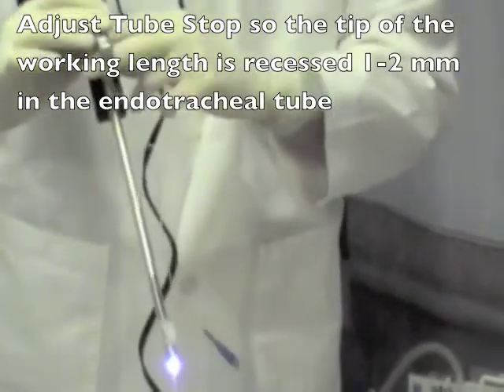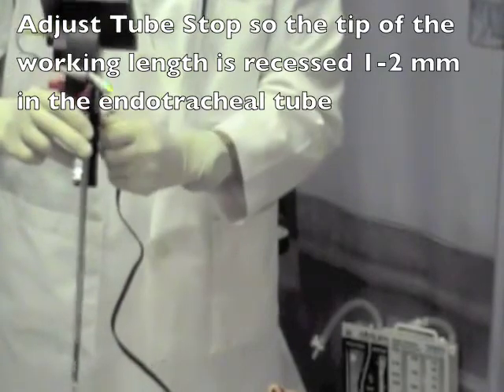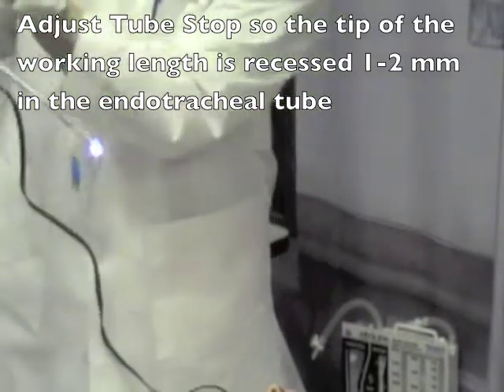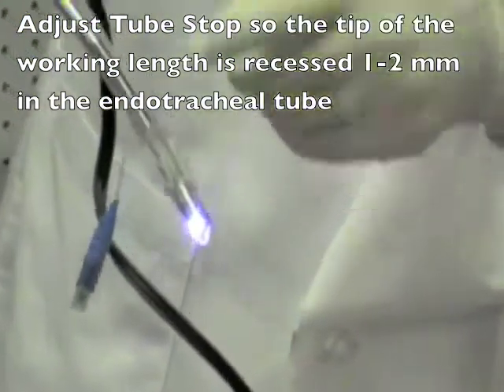Make sure that it is not too tight and that you can release it. Then turn your scope on and you will set the tip of the stylet just inside of the endotracheal tube.